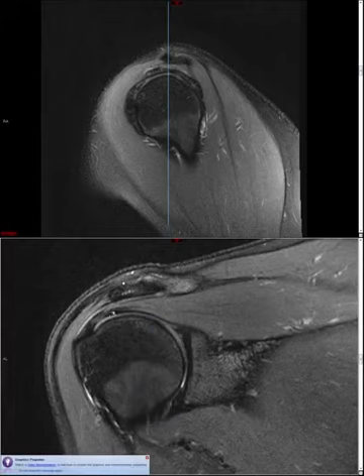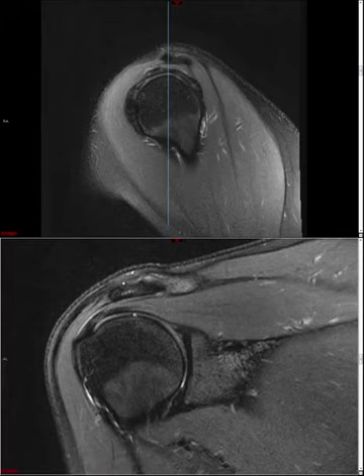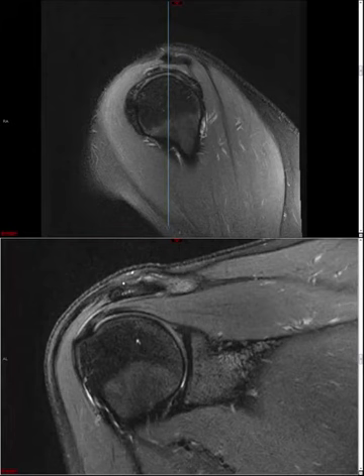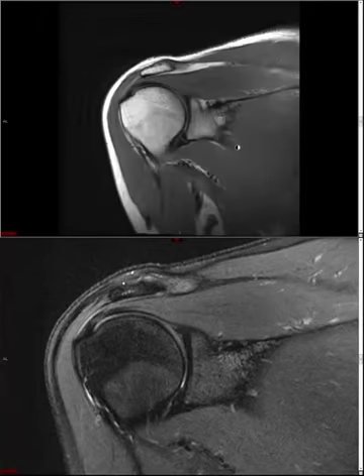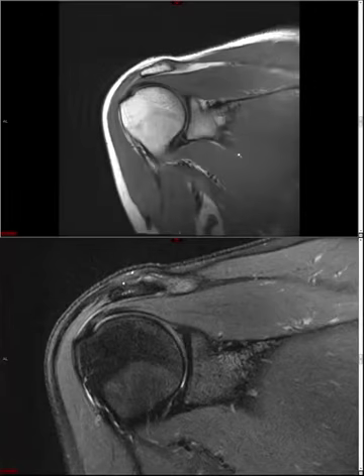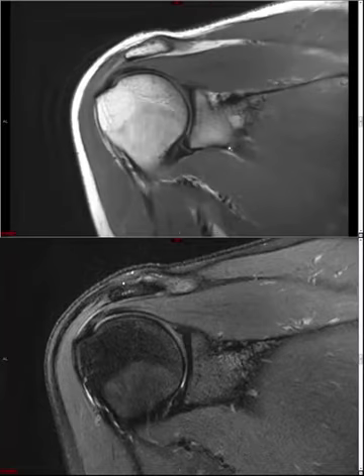You can give an approximate measurement of retraction, or be descriptive — saying retraction to the top of the humeral head, to the glenoid, or proximal to the glenoid. In the setting of a full thickness cuff tear, you should also try to ascertain how much fatty atrophy is present in the respective muscle belly, as this gives some indication of the chronicity of the tear.